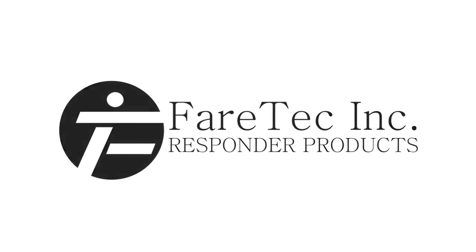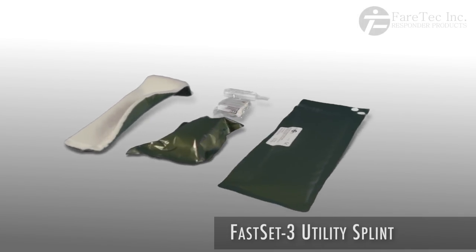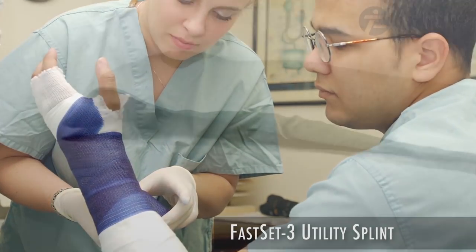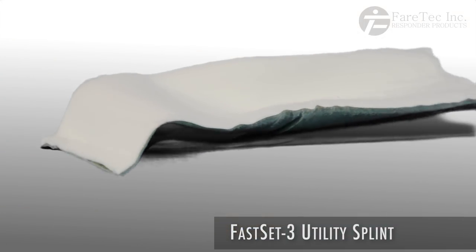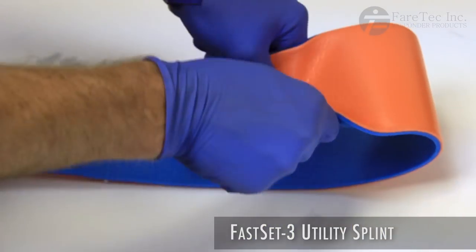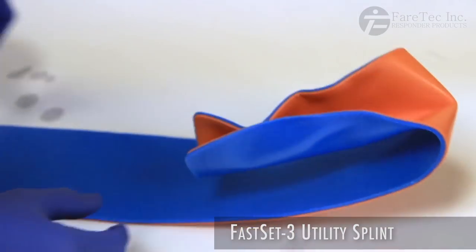The Fast Set 3 represents the next generation in utility splinting technology. The FS3 combines the advantages of a solid cast with the traditional elements of a utility splint. This product eliminates the need for the medic to form bends in the traditional aluminum splint, which can require valuable time and energy to form properly to a patient.